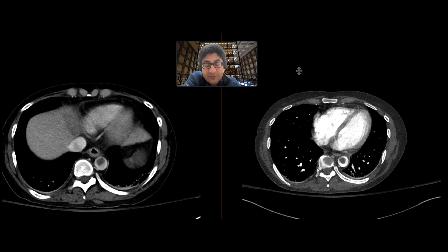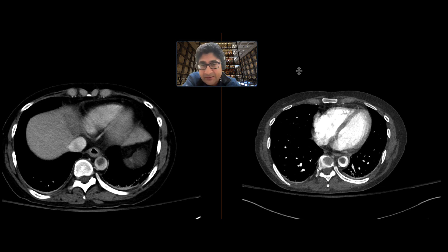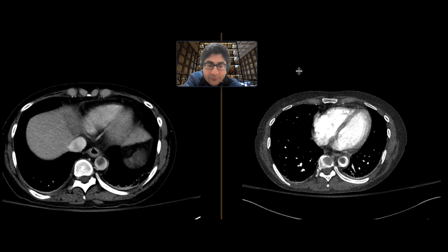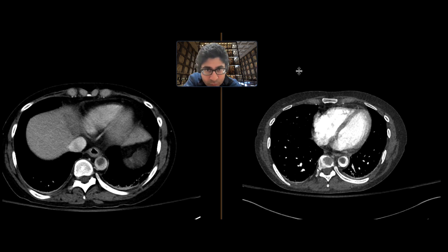This is a patient who came in with abdominal pain and had elevated lactate levels, and we got a CTA to further evaluate this. We got an arterial phase and a more delayed phase as well, and I'll show you the more delayed phase.